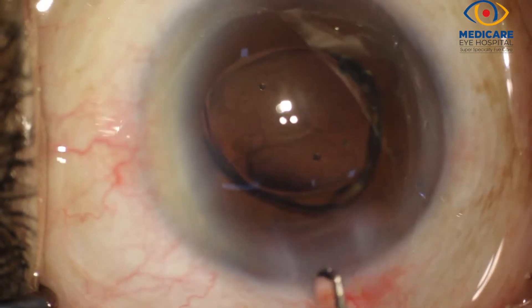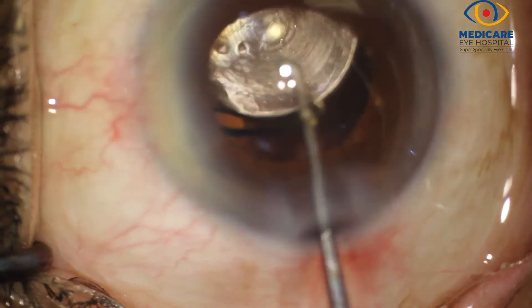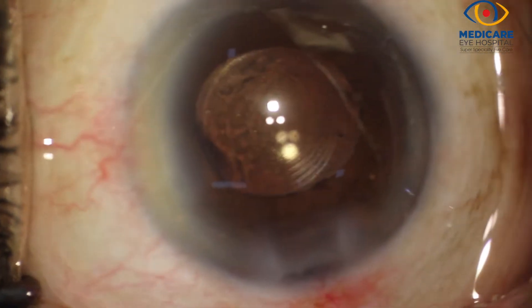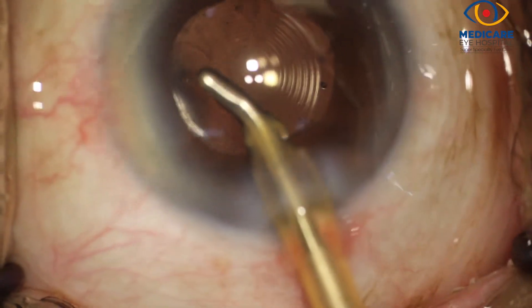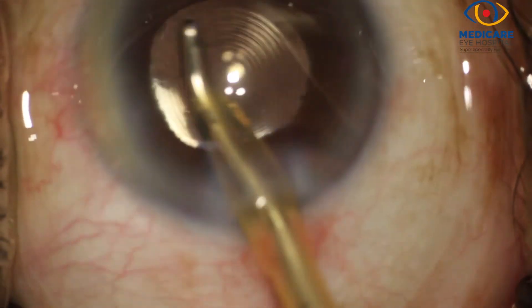The intraocular lens is placed in the bag and centred around the first Purkinje image of the microscope lights. As you can see, there are three of these lights — the upper larger circle is a halogen light, and the lower two smaller circles are from the stereo coaxial LED lights.